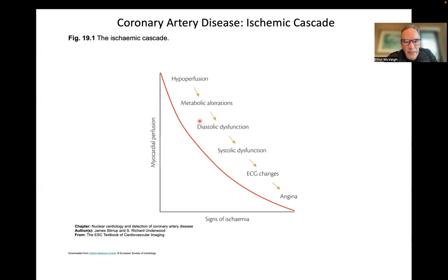After the maximum contraction, you look at some interesting lack of quick filling, called diastolic dysfunction, which can be a very early indicator that there is some kind of alteration to the muscle tissue. And this is well before you see something on, say, the patient's EKG.